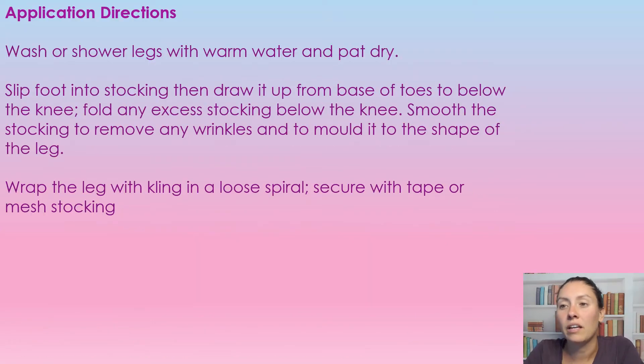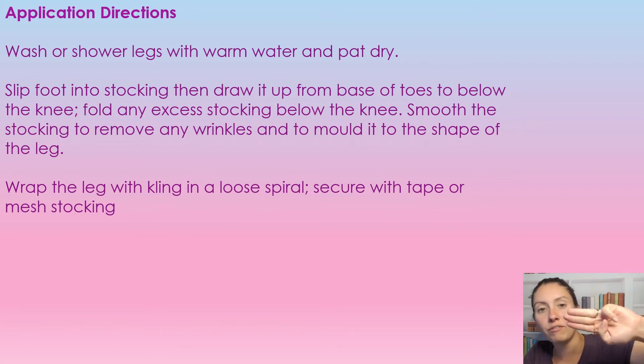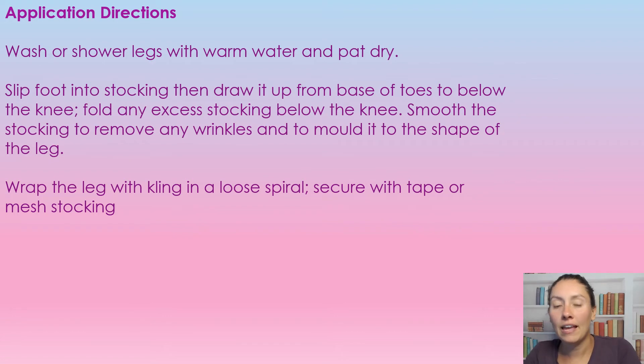To apply this dressing, first we're going to wash or shower the legs with warm water and pat them dry. Next, we're going to slip the foot into the stocking and draw up on the stocking to just below the knee — I normally say two to three fingers just below the knee. If there's any excess, you're just going to fold it over on top of itself to go downward. Then take your hands and smooth it out to firmly sit on the leg so it molds into the leg. Then you're going to either wrap the leg with cling in a loose spiral, secure it with tape and a mesh, or use your compression system at this time.